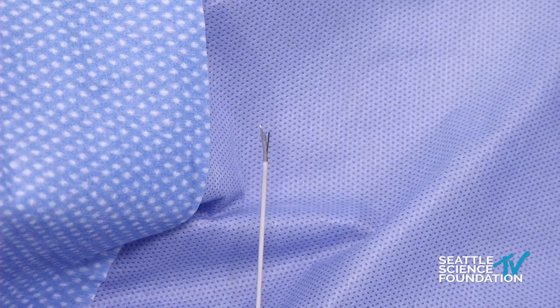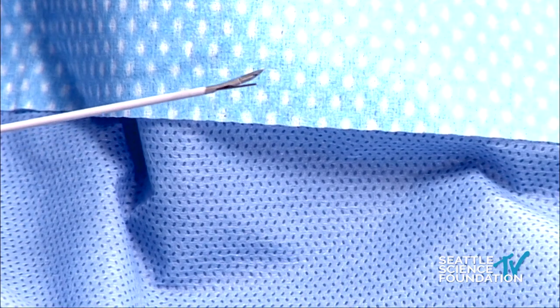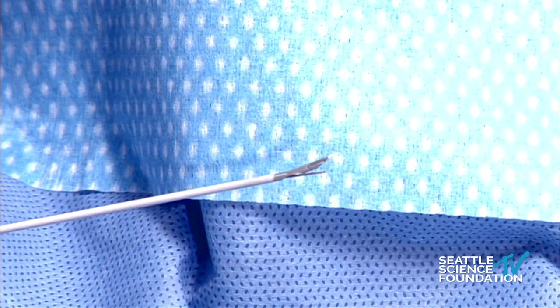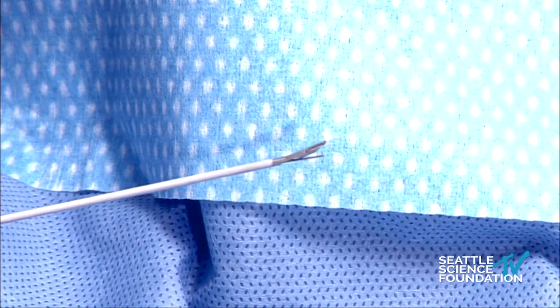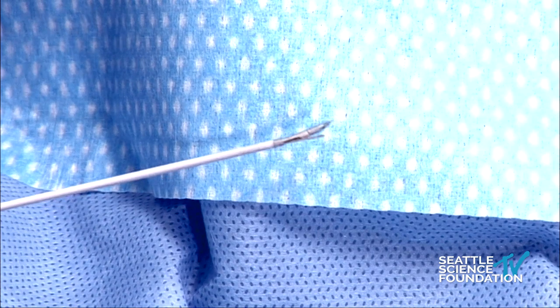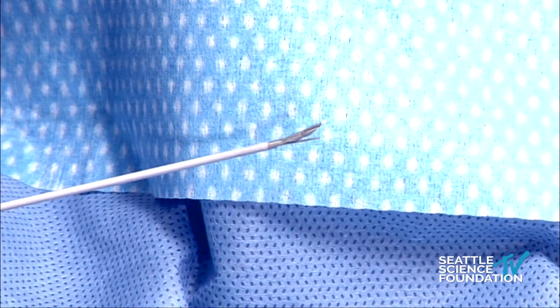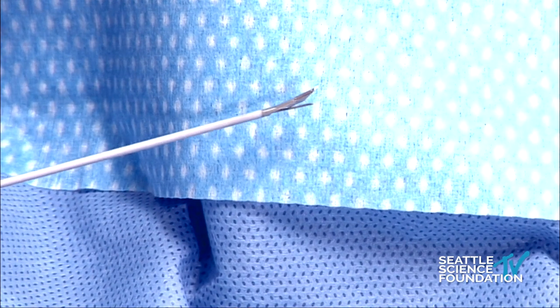And by using the larger lesion size that the Sidekick needle can provide, you are able to do that quicker. So I am able to find success in my patients doing third occipital nerve ablations just using 2 lesions, one on the inferior articular process of C2 and another at the very top of the superior articular process of C3. Also for some variable anatomy, like the lateral branches of the sacrum, the S1, 2, and 3 lateral branches, this is something to consider.